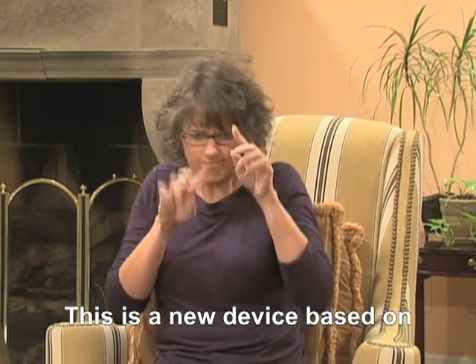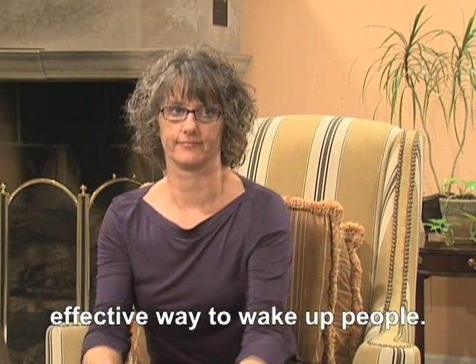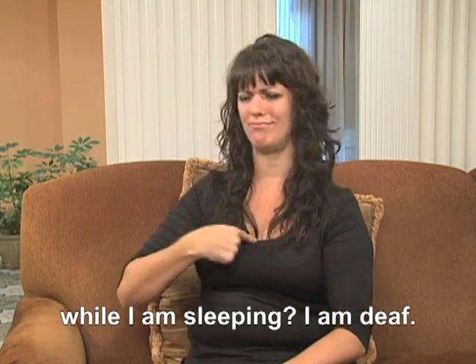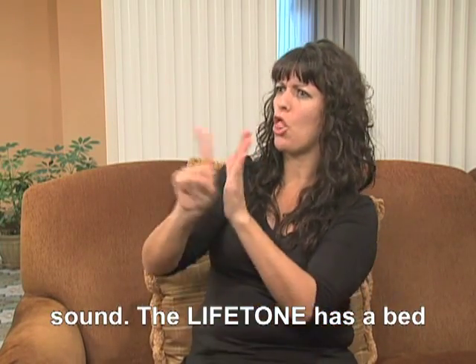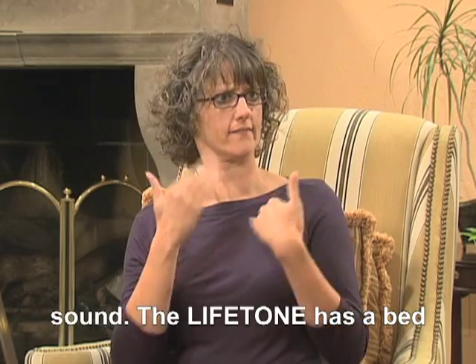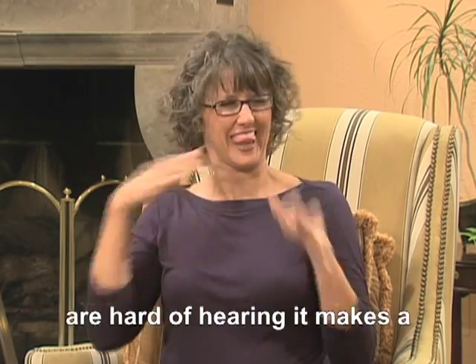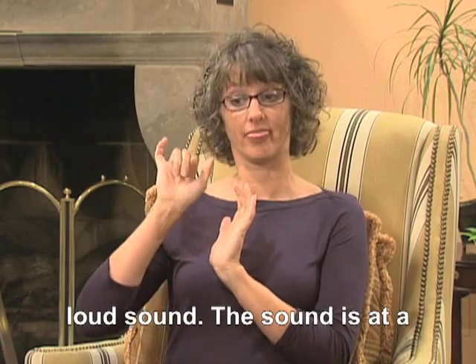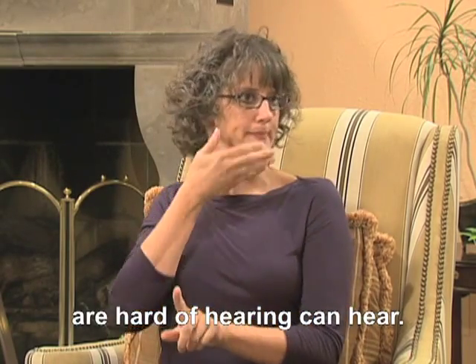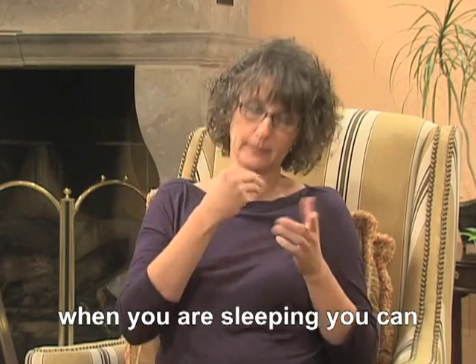This is a new device based on scientific research about a more effective way to wake up people. So how does the Lifetone alert me while I'm sleeping? I'm deaf. I can't hear the smoke alarm sound. The Lifetone has a bed shaker to wake up people who are deaf. And for people who are hard of hearing, it makes a loud sound at a low frequency that most people who are hard of hearing can hear. The Lifetone is by your bed so when you are sleeping, you can wake up.